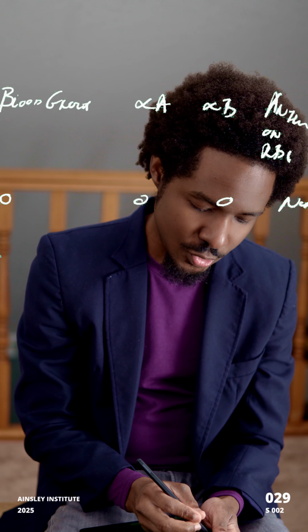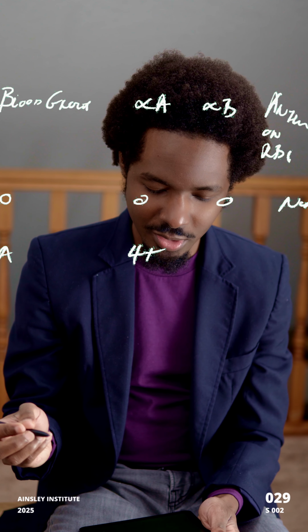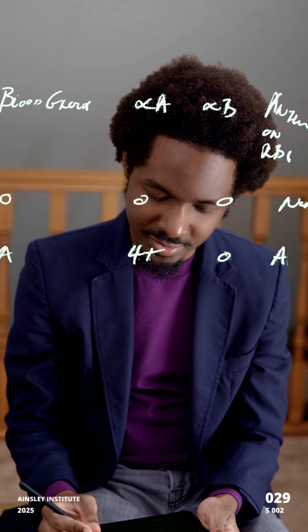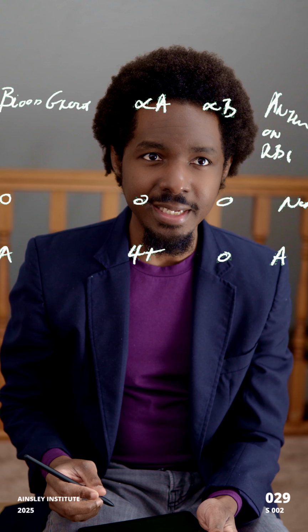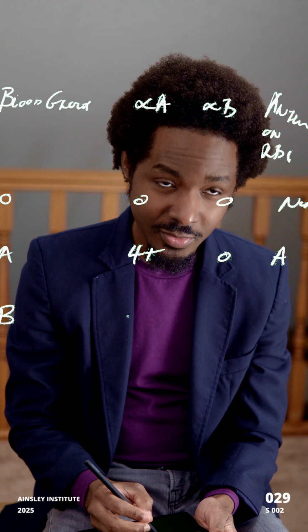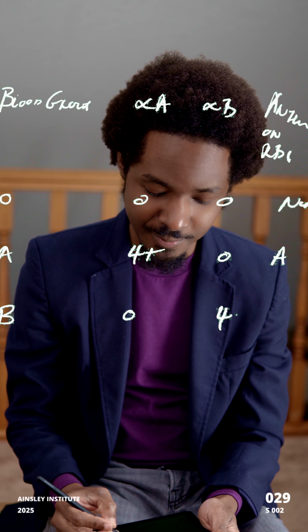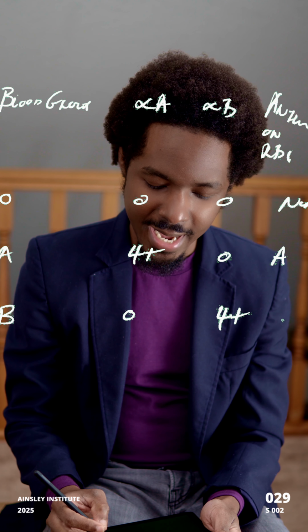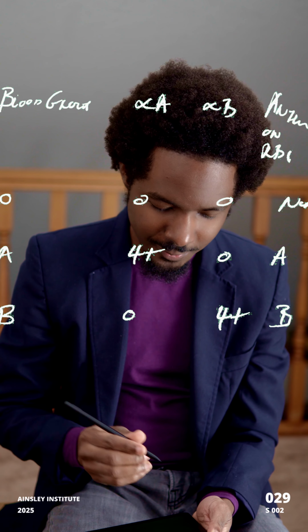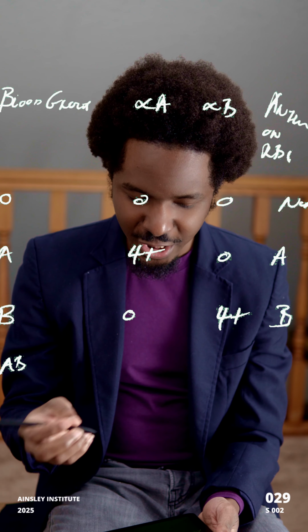All right, a person who is now A, we're expecting a reaction in A, no reaction in B, because this person has A antigen. Now a person who is B, we're expecting no reaction with the A, we're expecting a reaction with the B, and it is because there is B antigens. Now a person who is AB, we're expecting a mixture of reactions.